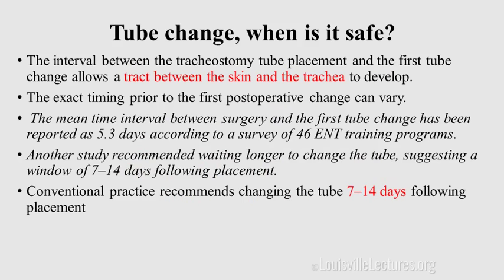Regarding tube change: I'm not talking about routine changes, but if you have an emergency, you have to know when the trach was inserted. If you change the tube too soon, you are at higher risk of creating a false trach because the tract between the skin and the trachea is not yet well formed. We usually wait anywhere between 7 to 14 days for the tract to form.